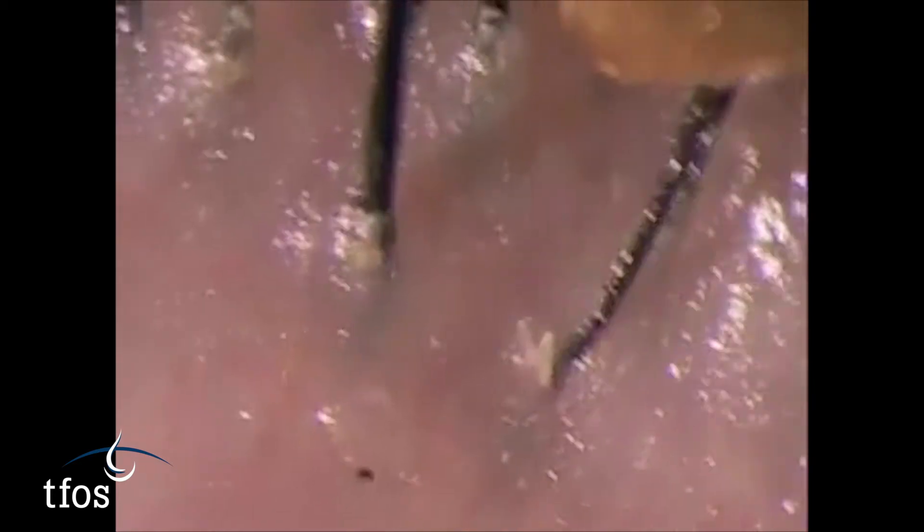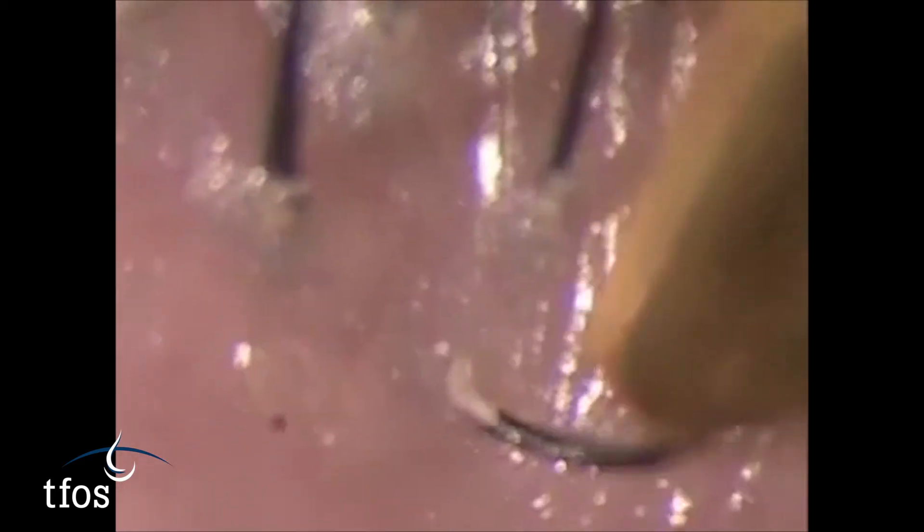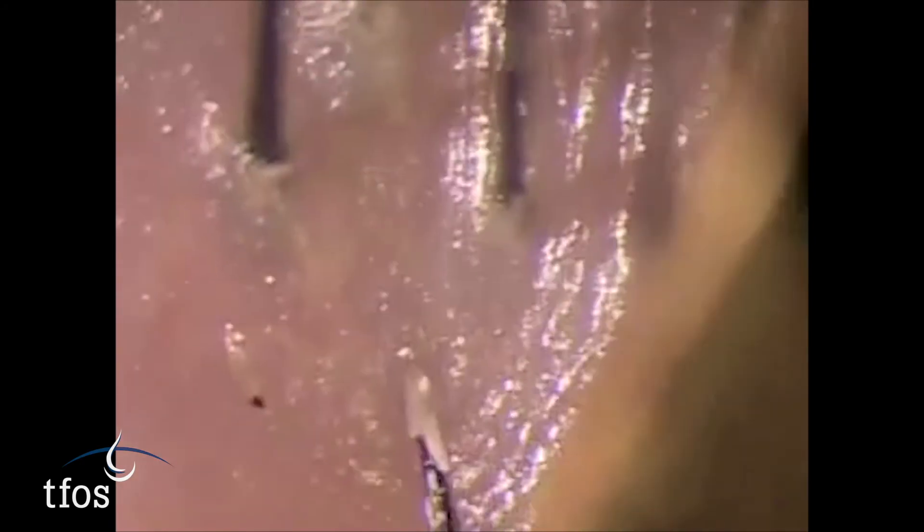To confirm demodex presence, detailed lash examination under high slit lamp magnification is required. Detection rates are enhanced by rotating the lashes for about 30 seconds prior to lash epilation and microscopic evaluation.